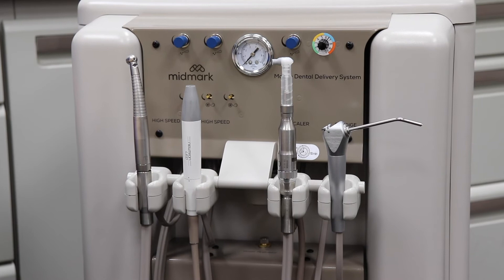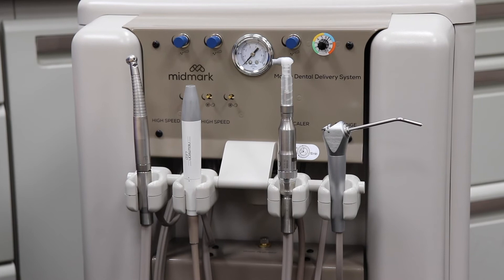If the low speed handpiece still is not operational, verify that you removed it from the correct handpiece dock. The tubing should align with the cradle that you removed the handpiece from.